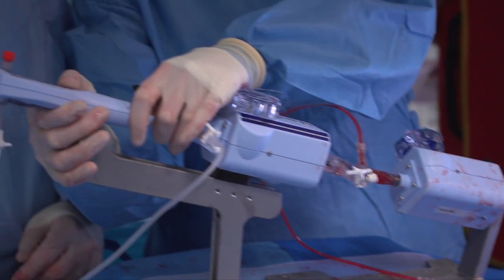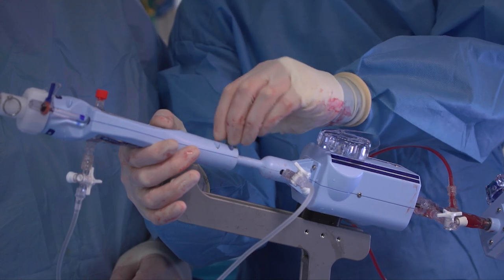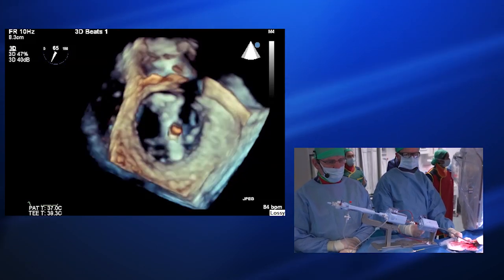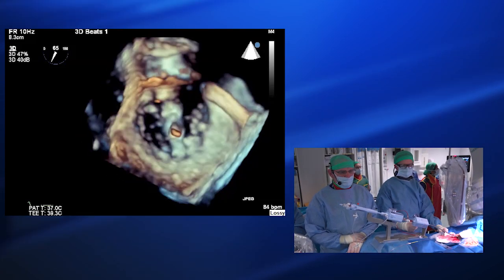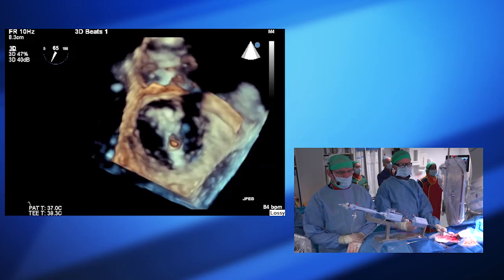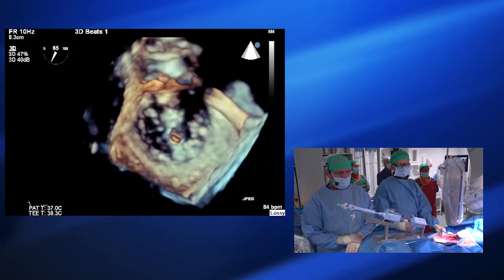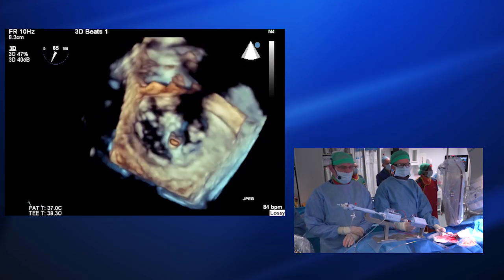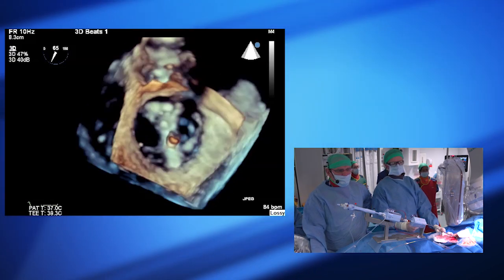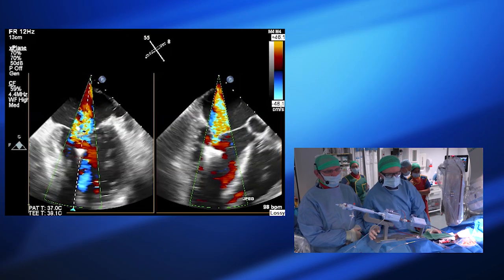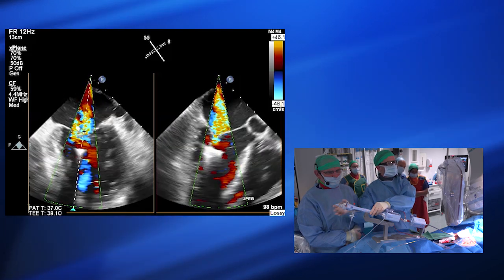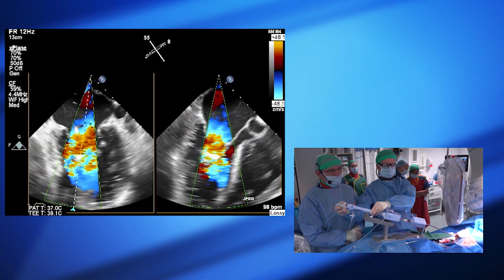We're now under the valve. I'll get a little closer just so we can see it, and let's recheck the orientation. For the medial side, you want to be sort of 11:30 and 5:30 — I think that's pretty good. Now we're ready to grasp. As you see in the right-hand image, that's our grasping view. I'm going to close the clip to about 120 degrees or so, and now I'm just going to retract.